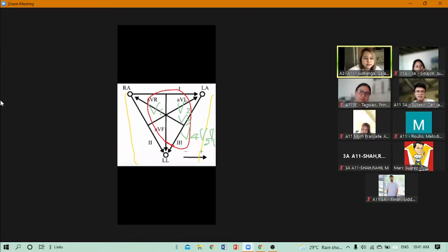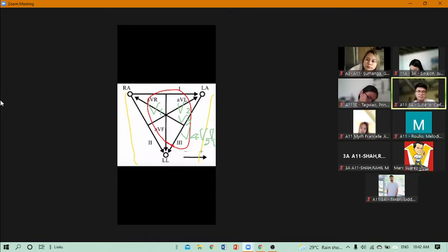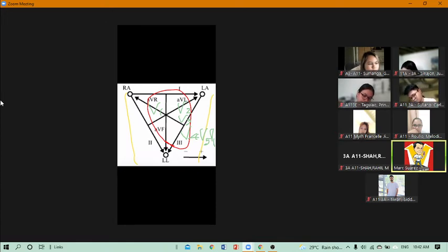Yes, Doc. So the limb leads deal with superior and inferior, right? The precordial leads deal with anterior, posterior. Very good. Horizontal plane, anterior and posterior. So please do not forget that one.